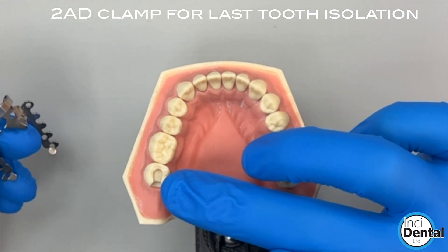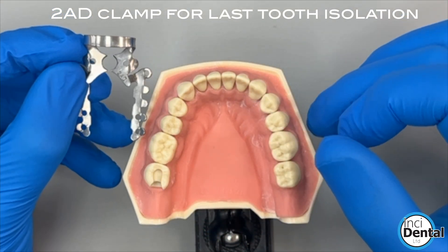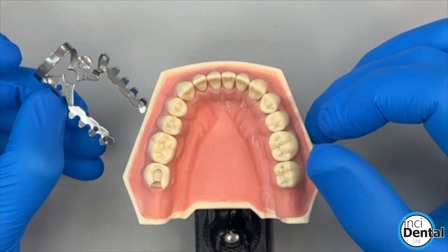Hi, in this video I'm going to show you how to isolate the last tooth in the arch using the 2AD clamp and a few of the other features of this clamp.